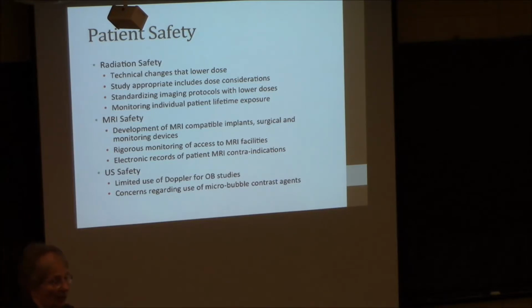MR is another area. I think that one's probably a little less. When we first got MR, there were all the stories about the buses that ran into the MR scanners because they were attracted by the strong magnet. Those have kind of died away. It's not really that big of a deal anymore. But we still have issues with implants in patients, pacemakers, things like that, which have gotten some resolution in the last few years. They're starting to make these non-ferromagnetic and non-sensitive to magnetic field devices and what have you. The biggest problem we have now is figuring out which one the person has in them. But basically, that's being handled.